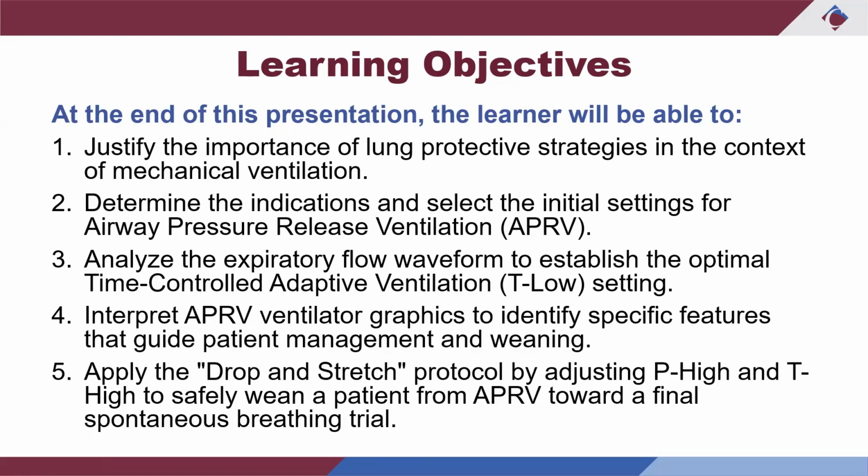Interpret APRV graphics. So again, this is something important that a lot of times I look at at the bedside. I watch the screen and I watch the patient, and I want to see if they're synchronized. Are they triggering breaths? Are they not triggering breaths? What type of inhalation exhalation pattern do they have? Are they pushing air out? And we'll show you some waveforms, what it looks like when we're over distending them. And again, then we'll talk about the weaning side of it.